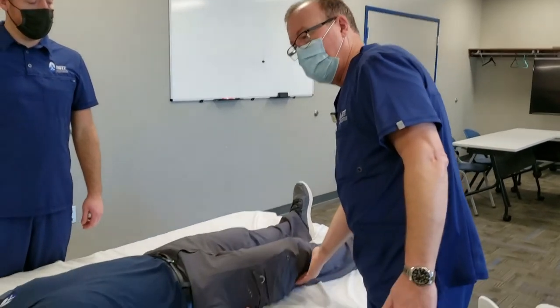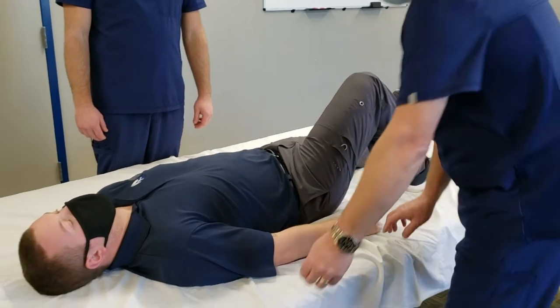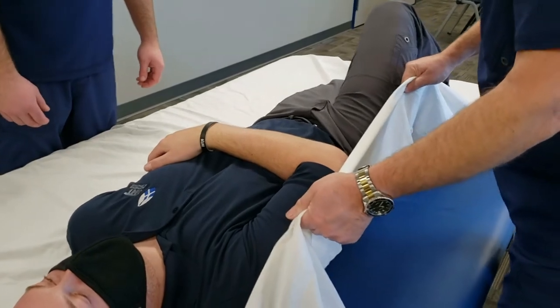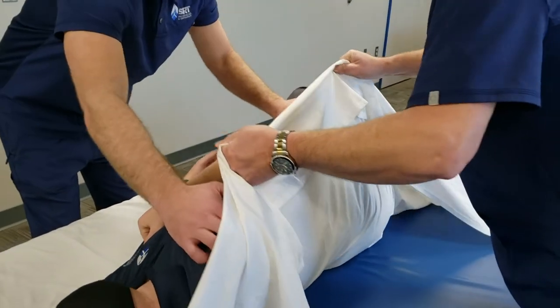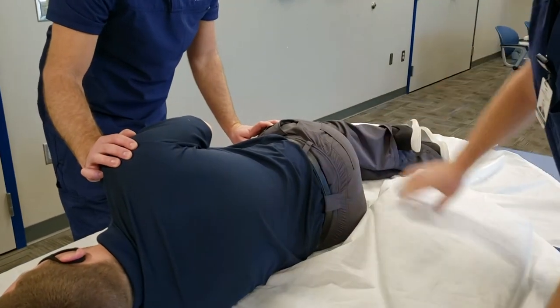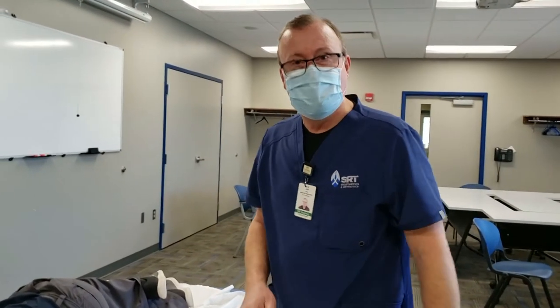Log rolling can sometimes be intimidating for people taking care of a patient like this. But one thing that can make it a little easier: always have them bend their knees up — it's just going to help in the process. You might also be able to grab the sheet underneath them and use that to help them roll, so you're supporting them the full length of their back and torso. That makes log rolling easier and less nerve-wracking.